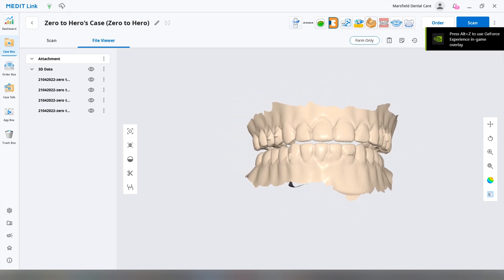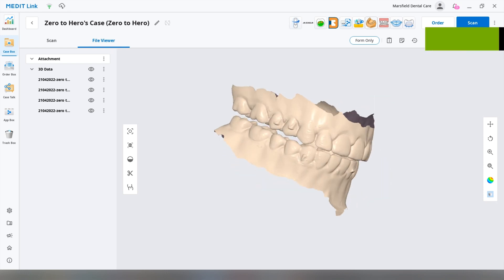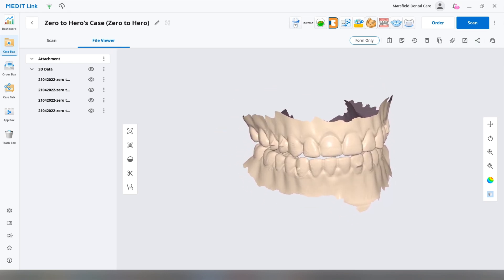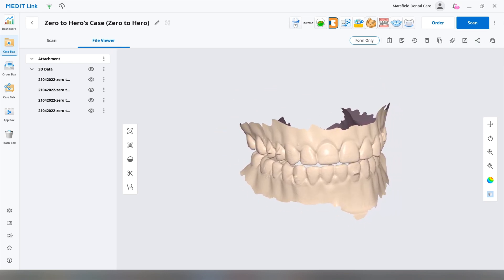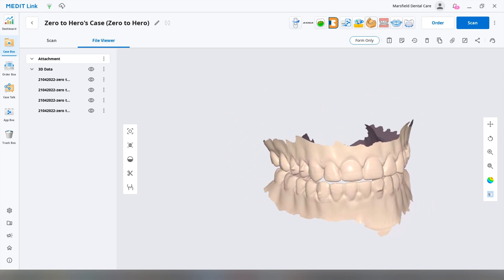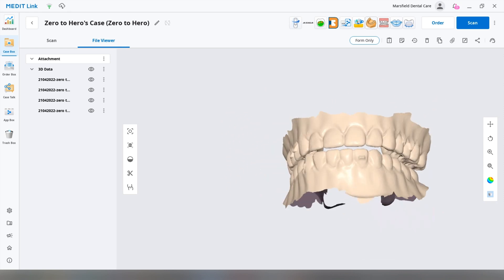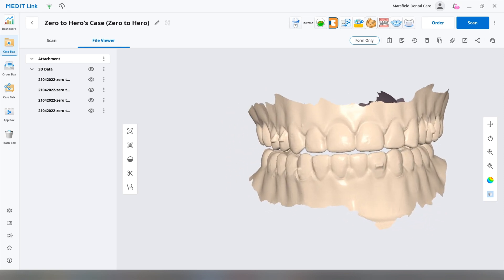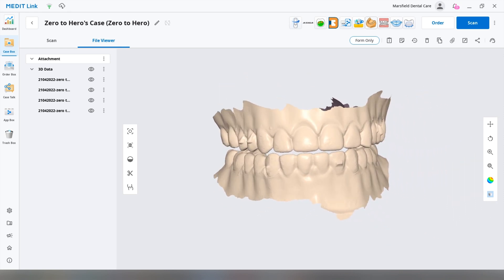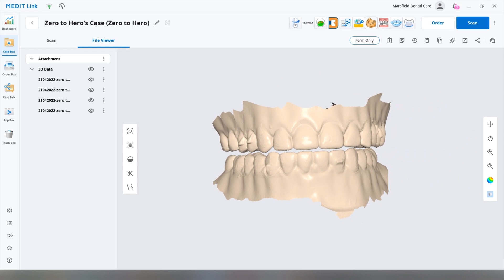Okay, now whenever you see a model like this, basically right click hold is to rotate, the middle click, middle scroll button, hold it down, and that's going to reposition your model. Okay, scroll in and out, that's to zoom in and out.